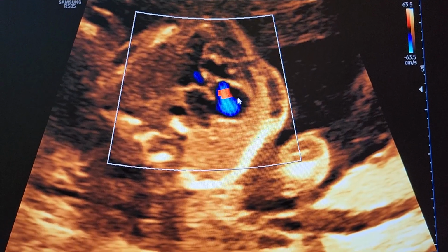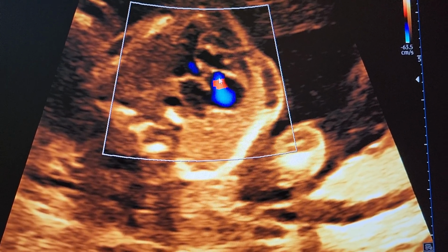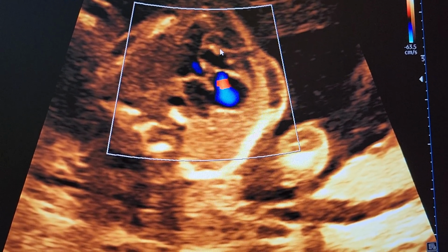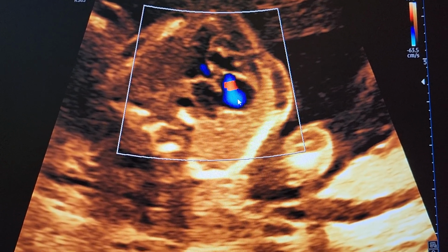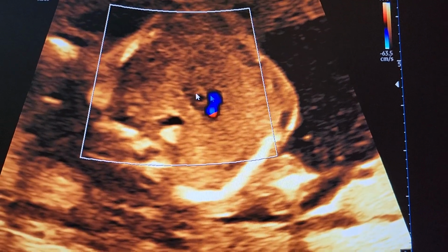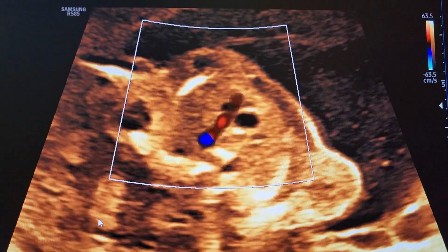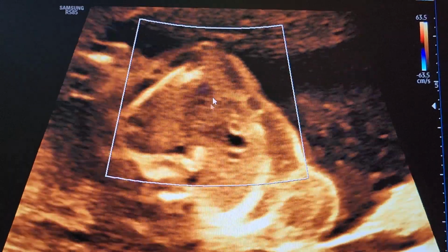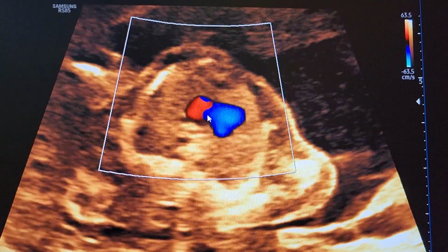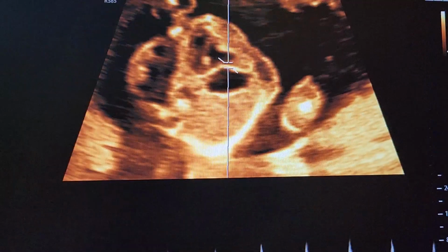Now when we look at flow across the tricuspid valve, we saw a small opening, and now this is the large regurgitant jet. You can see this is blue. So flow from RV into RA as a regurgitant jet reaches the roof of the RA. That's the large tricuspid regurgitation. Now we can see the reversed flow in the ductus arteriosus, antegrade flow in the aorta, reversed flow in the ductus arteriosus in this loop. So that's the reverse flow in the ductus arteriosus.